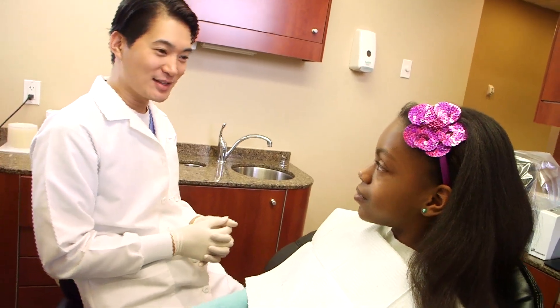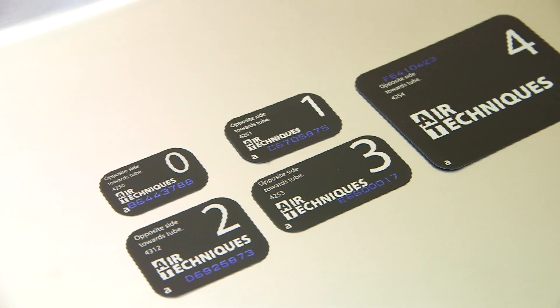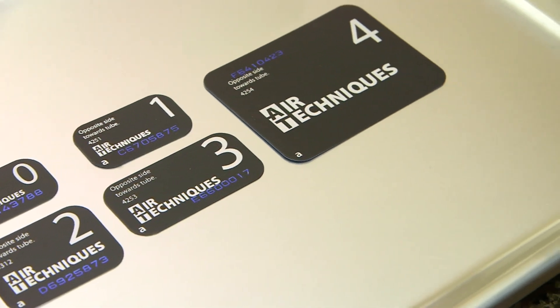My practice, like many of yours, treats patients of all ages with mouths of all sizes. ScanX PSP sensors come in sizes 0, 1, 2, 3, and 4, so they accommodate children, adults, and those with TMJ issues, large tori, gaggers, and geriatric patients.